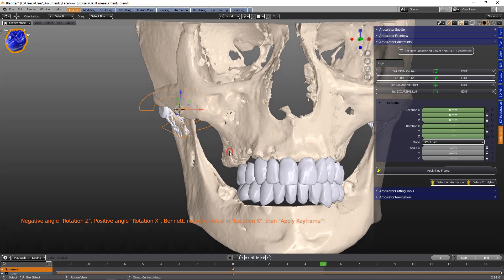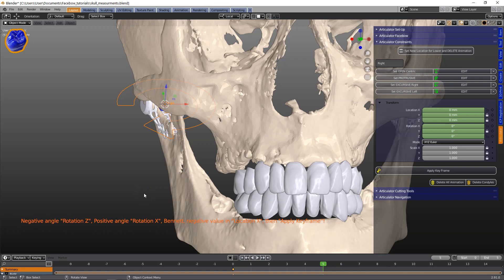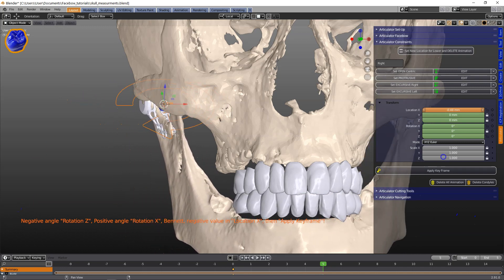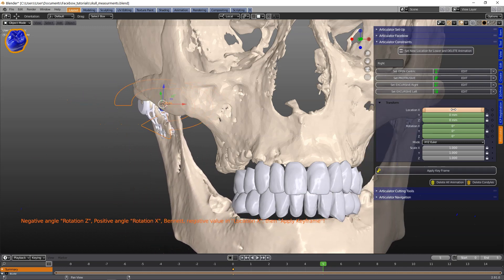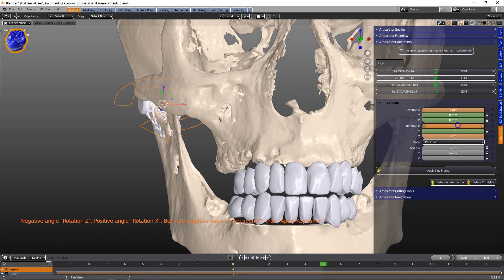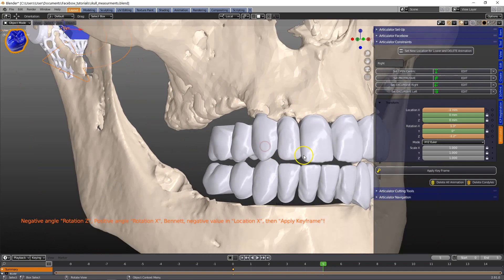Setting the excursive right movements, we're going to set a Bennett side shift. The Bennett side shift is around 1 to 2 millimeters. This will shift the side outwards — here it's a negative value, minus 1. Then I'm going to rotate the jaw a little bit to the right-hand side and close it.